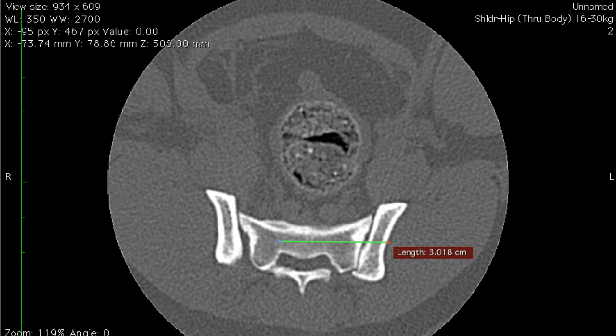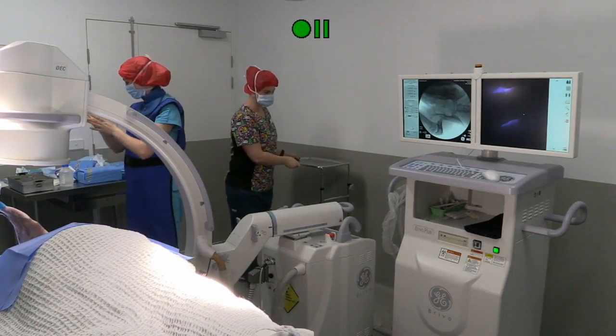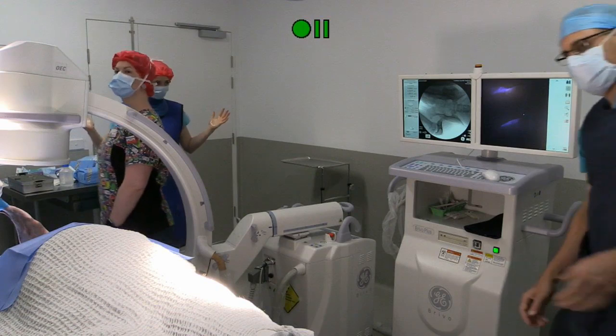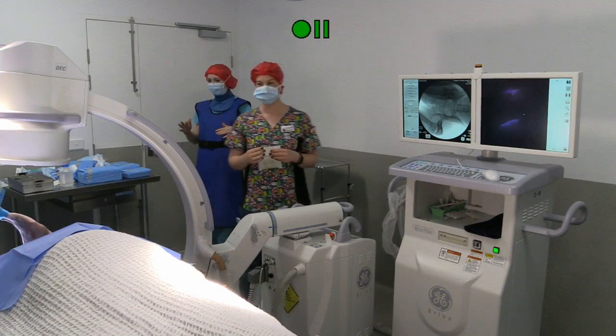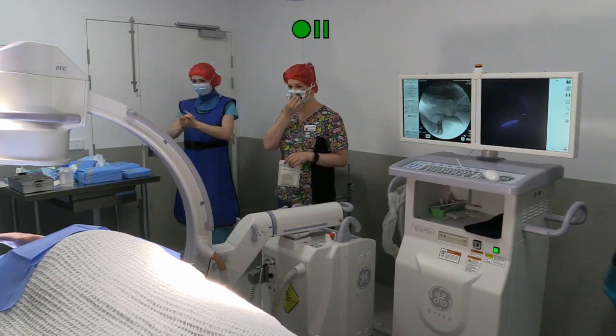And then the other thing I do is just measure the width of the sacrum where we put the screw to help choose the screw placement. Yep, so the width here is about 7.5 millimeters. Yep, 8 millimeters. So in terms of deciding on implants, you have some really nice headless compression screws, but they come in a 3 millimeter size and a 4.5 millimeter size, so I think they're going to be slightly too small and slightly too big. So I think they're going to run them in a 3.5 millimeter cortical screw placed in lag fashion. So I'm going to switch the microphone back over to the camera. That'll give you a little bit clearer audio when I get back closer to the camera side.